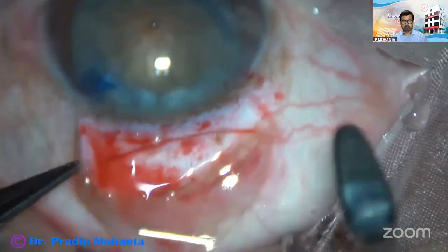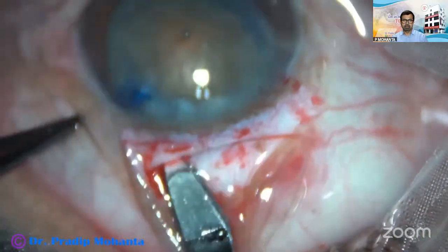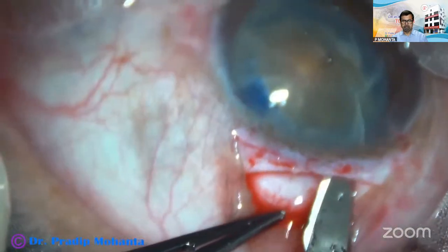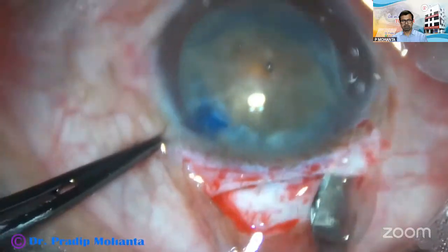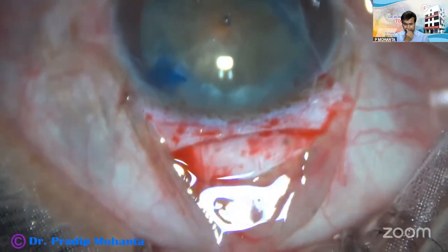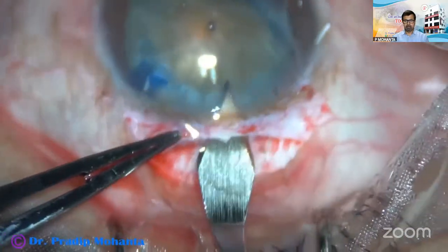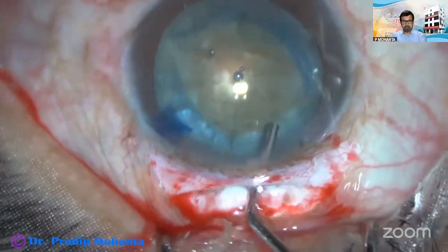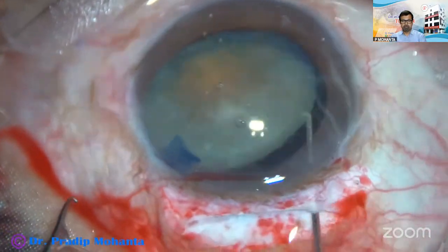A crescent blade is used to make the tunnel, and the tunnel is completed. Rhexis is already done, so we just have to prolapse the nucleus and deliver the nucleus. Whenever there is extension of the rhexis, run out of the rhexis, this is the tunnel being opened. Whenever there is run out of the rhexis, I usually prefer fish hook to deliver the nucleus.